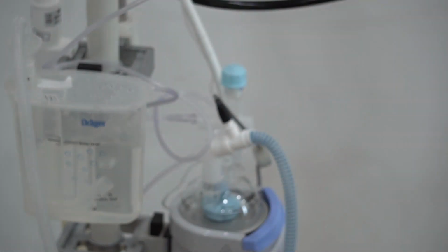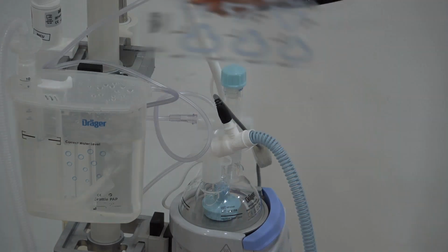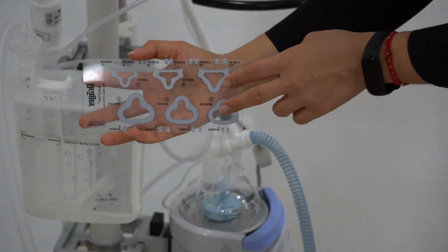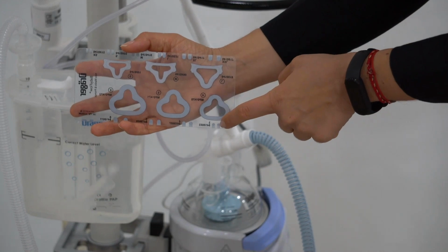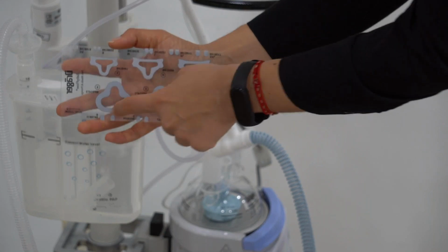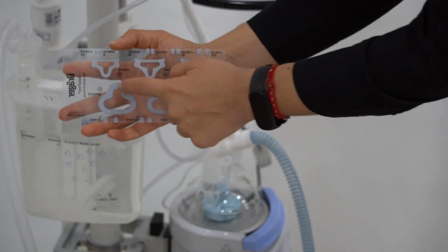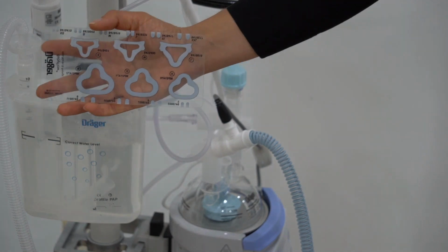However, I do understand we have different sizes of masks, and we also have this guide on how to select the right size of the mask. So basically, you can measure, first of all, the nasal distance, the distance for the prongs, and you can select the right size, and you can also measure the area in order to find the right fitting size of the masks.